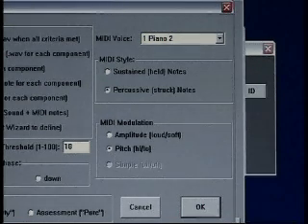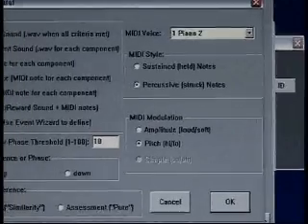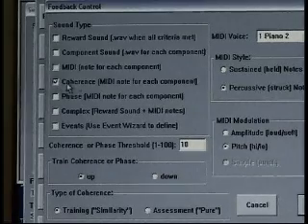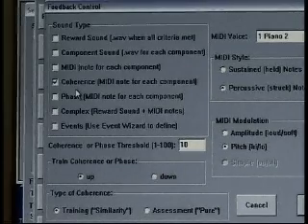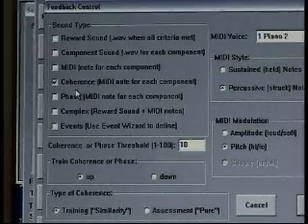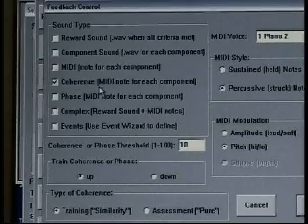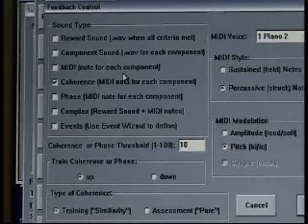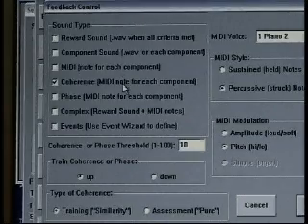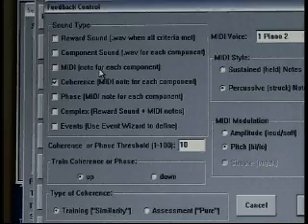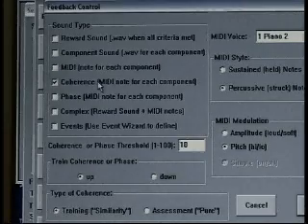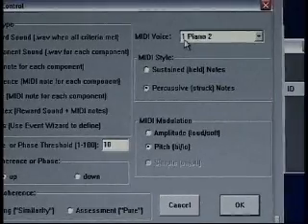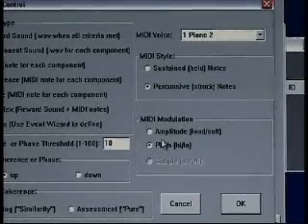Scrolling slightly back over to the left, we'll turn MIDI off. Our next option is coherent sounds. Coherent sound is specific for coherence training, and the definition is MIDI note for each component — similar to MIDI, other than MIDI was for amplitude training and coherence is for coherence training. We still need to make the same decisions on instrument, style, and modulation.